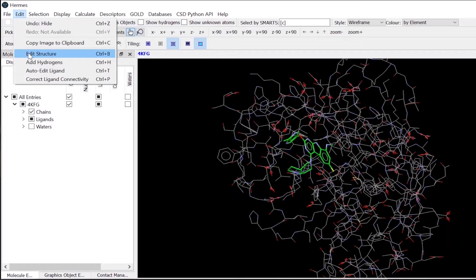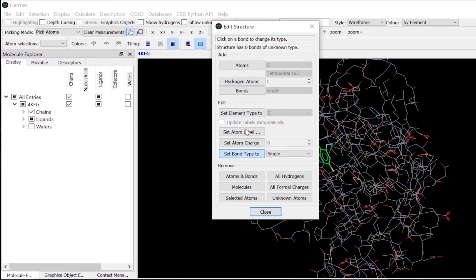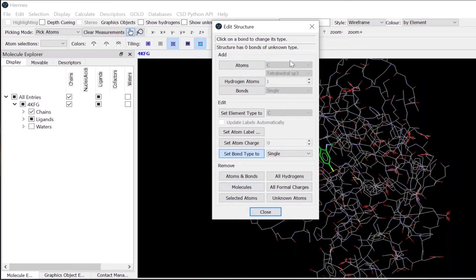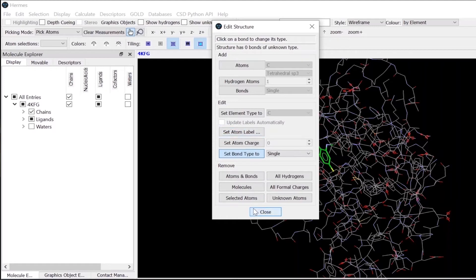So we have here the edit structure, which you can generally use if you have a disordered ligand. You can then add atoms, bonds, or set atom labels, or you can perform different types of functions here and edit your ligand molecule.